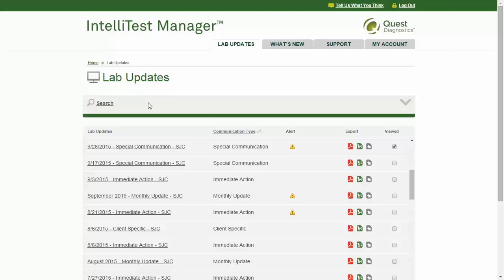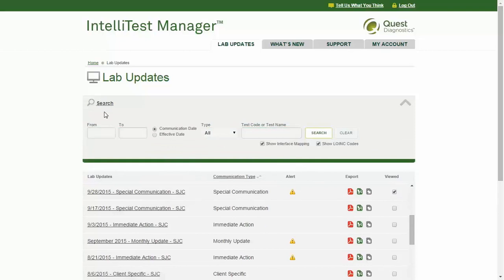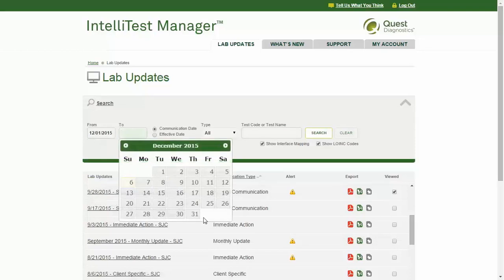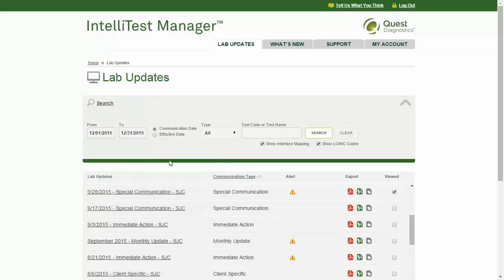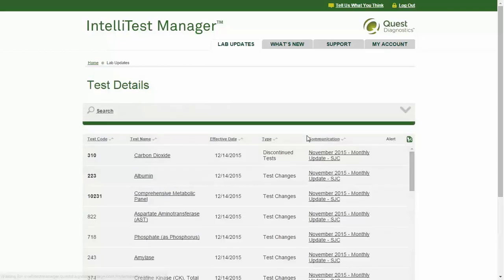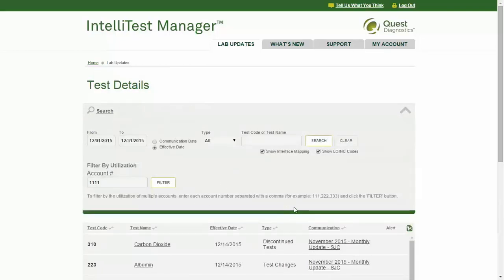Click Search to expand this section and display options for searching specific communications. You may search for items within a particular date range. For instance, if preparing for upcoming changes, you might search by the effective date to know what will take place within the next week or month. Or, if returning to work, you could search by communication date to locate what you missed. After search results display, you can filter them by your account utilization, which will show only communications related to tests ordered by your account within the last 12 months.